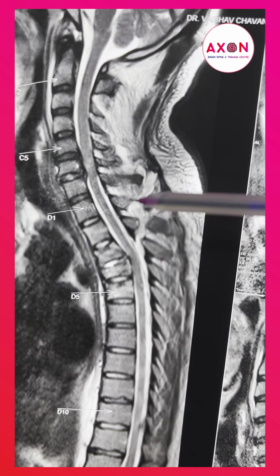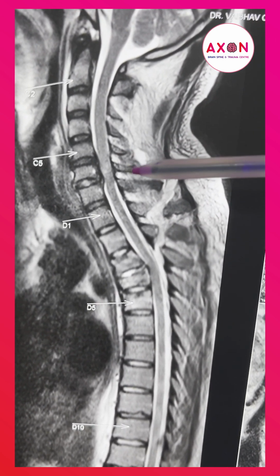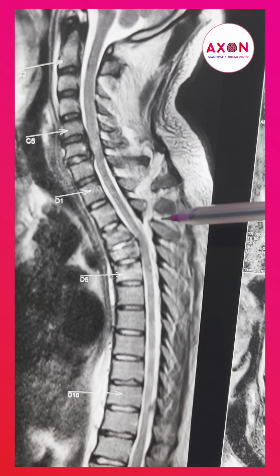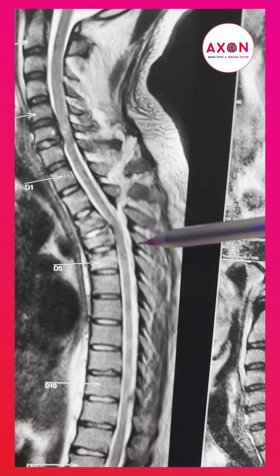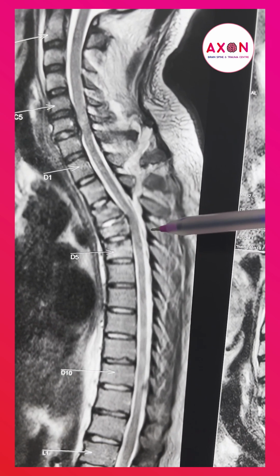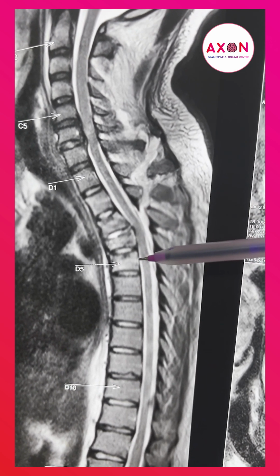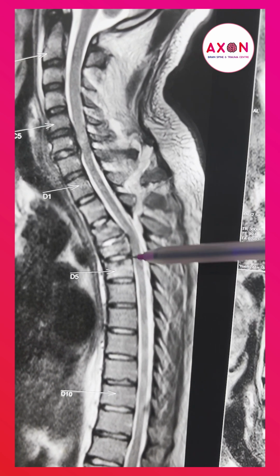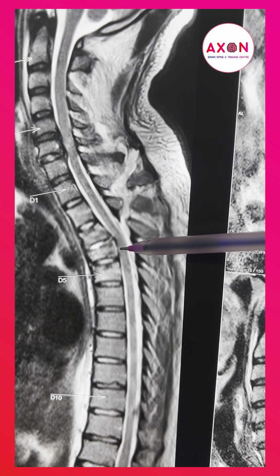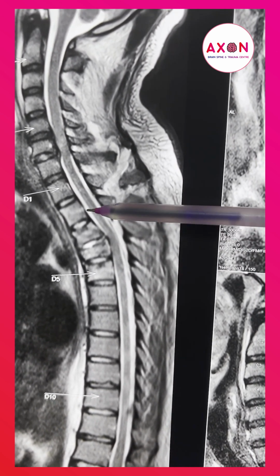So my initial plan for this patient is to do a cervical laminectomy as well as a thoracic spine fixation in the same sitting. It's going to be a long surgery. So my plan is to put screws in D5, if possible a single screw in D4 in the fracture fragment, and on the D3 or D2 vertebra.